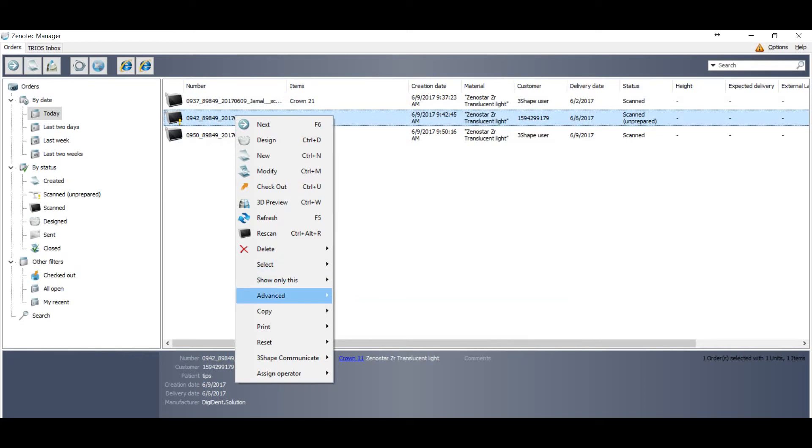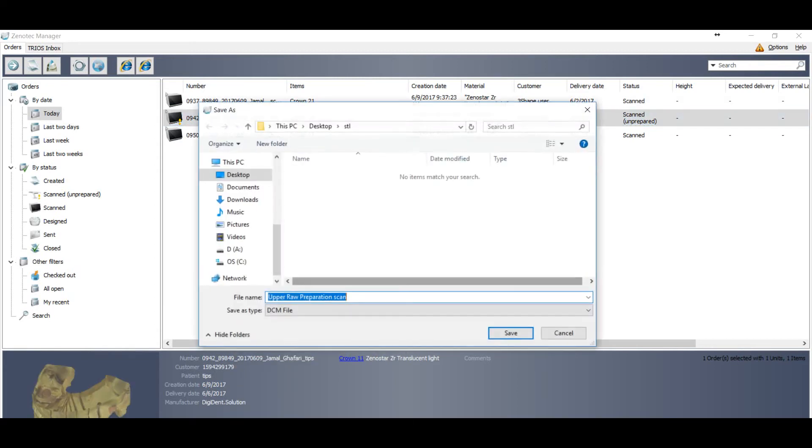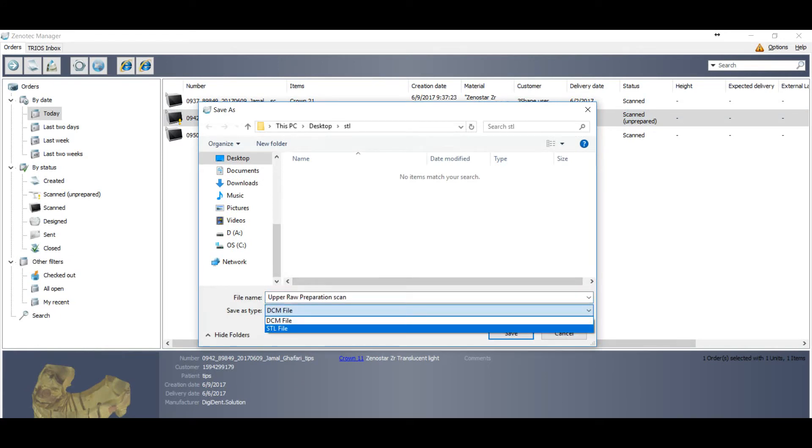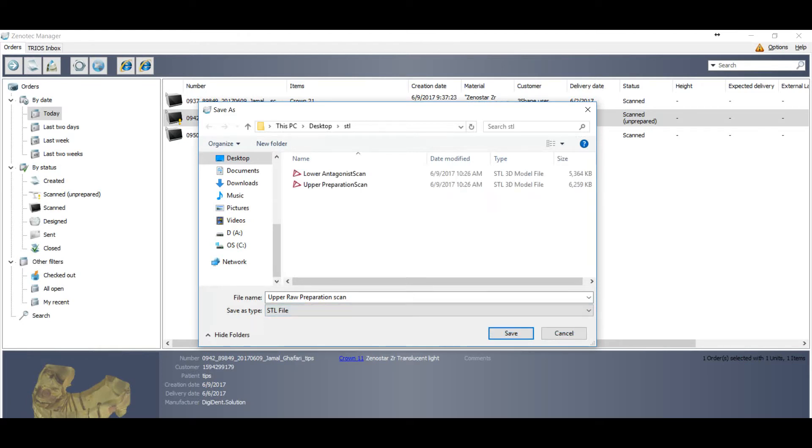Same you can do with the order with the yellow mark. You can go to the advanced, you can go to the export scan, export scan, then you can click. Here again you have two options: STL and DCM.